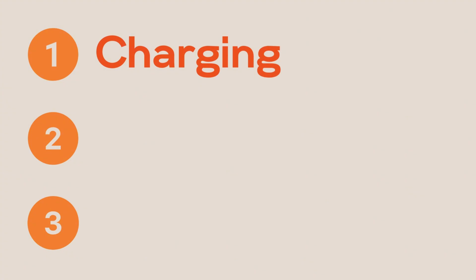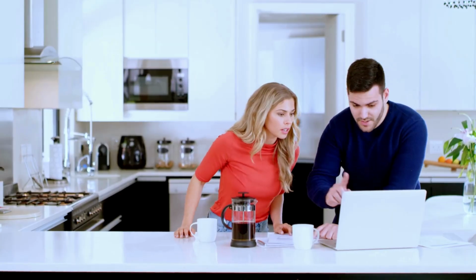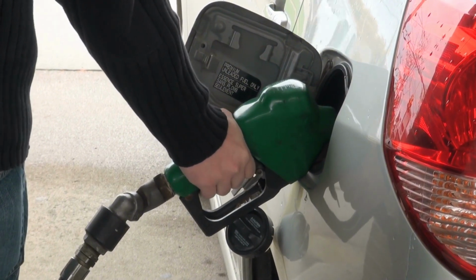First things first, always use the charger that came with your LUMEBOX. Using a non-LUMEBOX charger could seriously impact your battery's performance and lifespan. I know it can be tempting to borrow your friend's charger for a similar looking device. I mean, think of it like putting the wrong fuel in your car. It's just not worth the risk. Stick to the LUMEBOX charger and you're already ahead of the game.